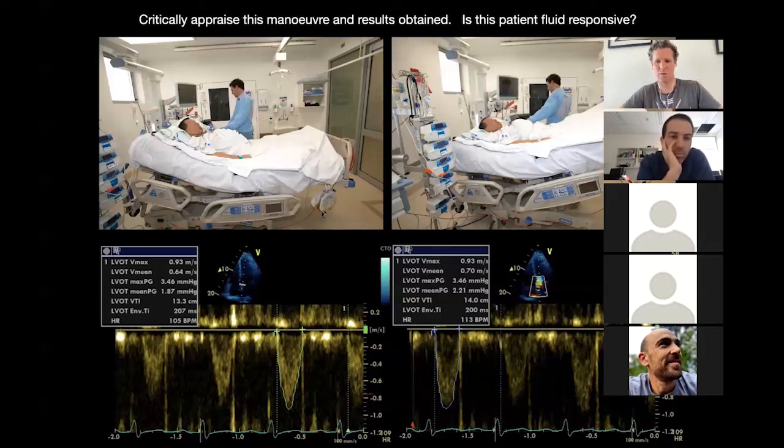Yeah, nice. And the passive leg raising, if you just look at the patient positioning, probably the legs could have gone a bit higher to 45 degrees, I think is in my mind the angle. Yeah, it is. And one of the problems that we've got is often with these Hill-Rom beds is that you can't do that. This is the maximum that the beds go to, and they always talk about moving the bed rather than lifting up the patient's legs.